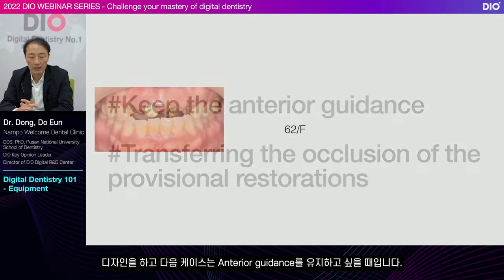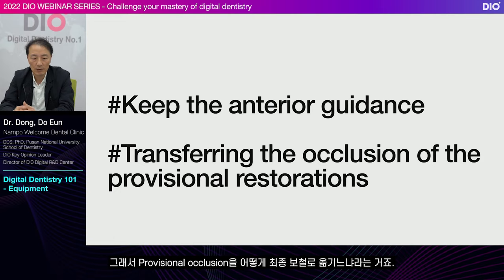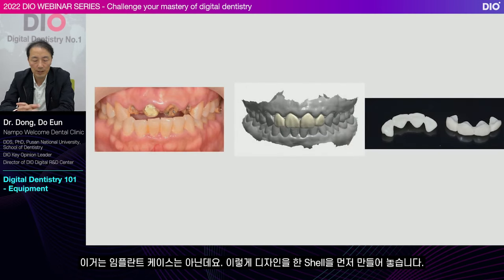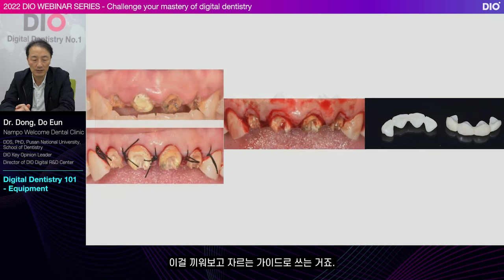The next case is when you want to maintain the anterior guidance. So, how do you transfer the provisional occlusion to the final prosthesis? This is not an implant case. You make the designed shell first. Scan the mouth and use this as a guide to cut out the gum. It's not about cutting the gum arbitrarily, but determining how much to cut by placing this and using it as a guide. So proceed with gingivectomy.